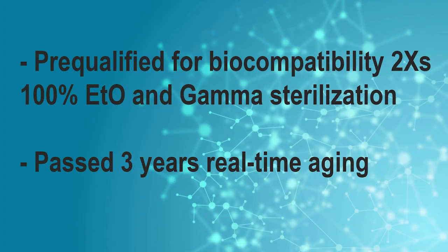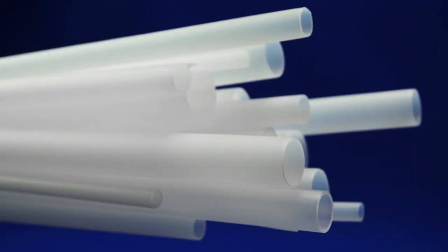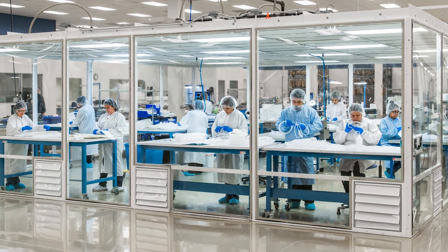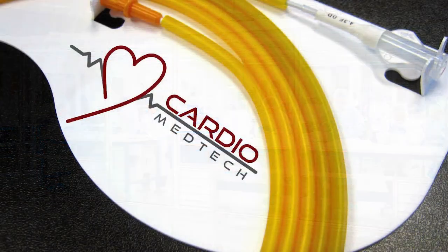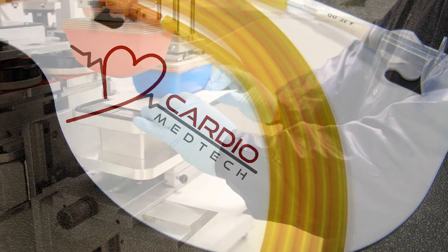The clipless catheter dispenser and backer card material is pre-qualified for biocompatibility, two times 100% ETO and gamma sterilization, and has passed three years of real-time aging. Clipless dispensers can be manufactured in assorted tube diameters and lengths and are manufactured in our ISO certified Class 8 clean room for crystal clear markings.